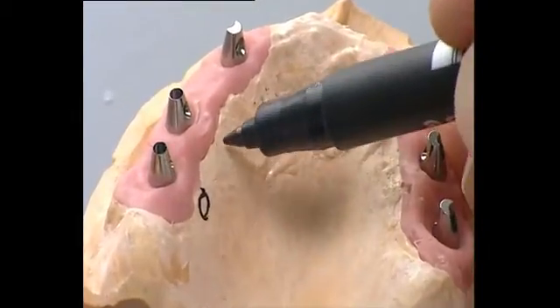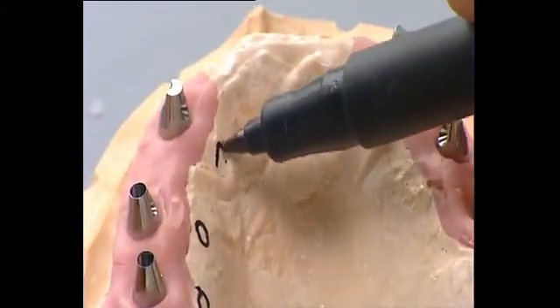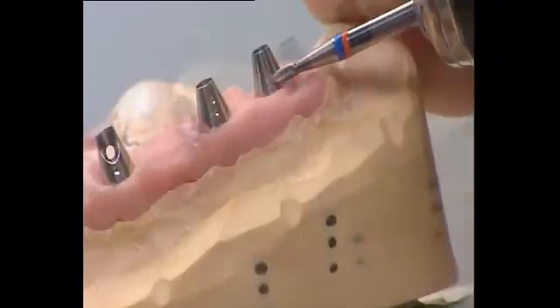The UV-E abutments are marked according to their position in the dentition to avoid any mix-up. The position is marked on the labial surface of the abutments and indicates the correct intraoral position for the dentist.